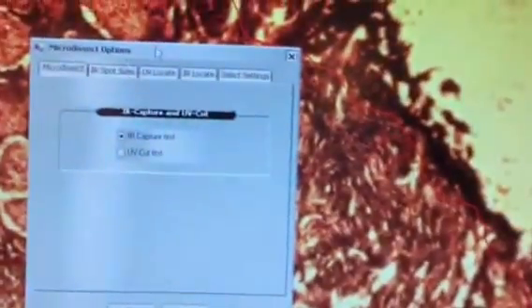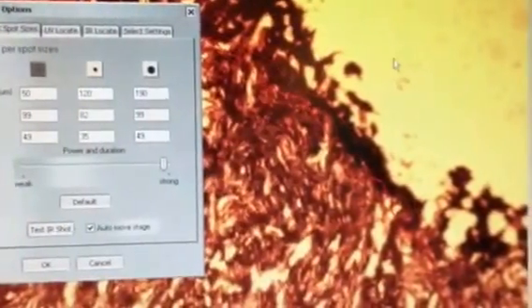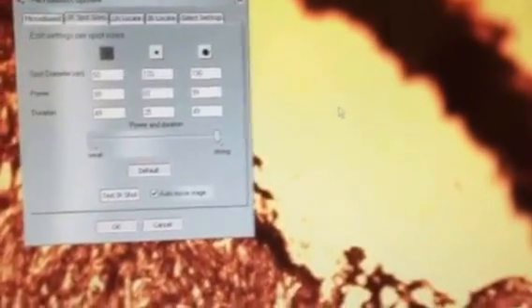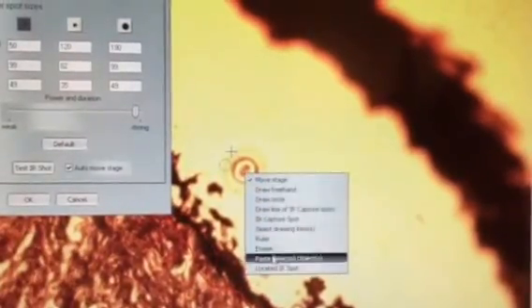You can see our lines. The lines are going to be the UV cutting, and the circles are the IR spots. The first thing you have to do is test your spots, and set your locations, and then you simply hit capture and cut, and the system does the rest.